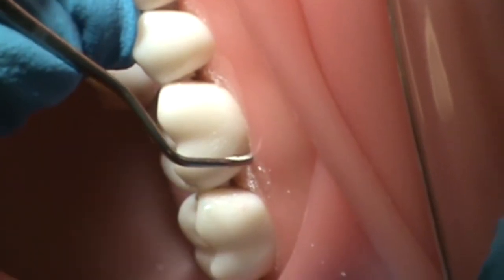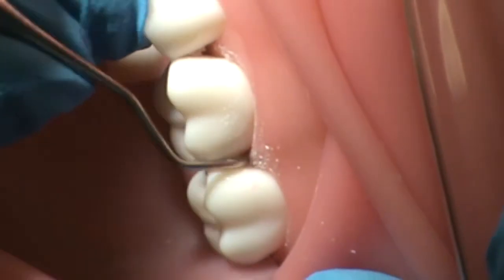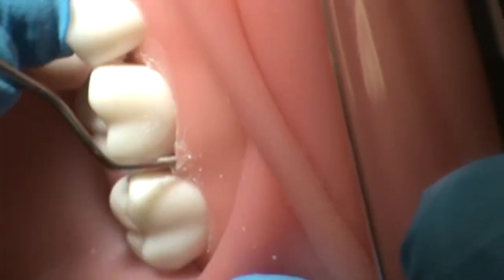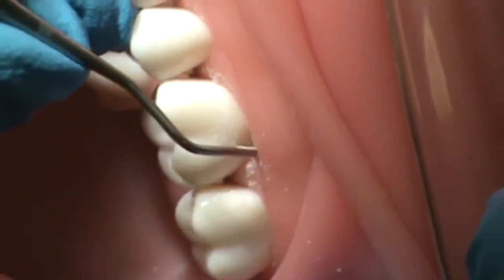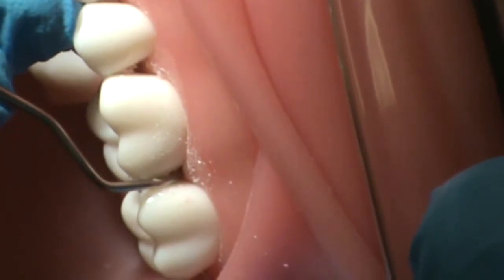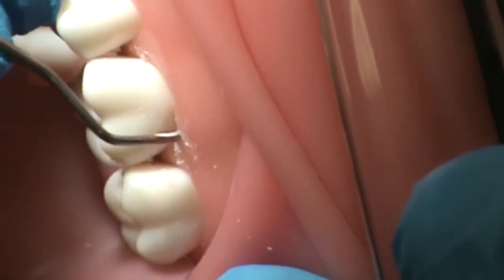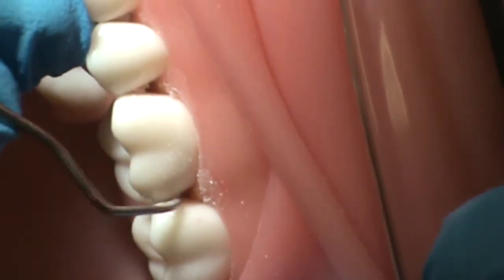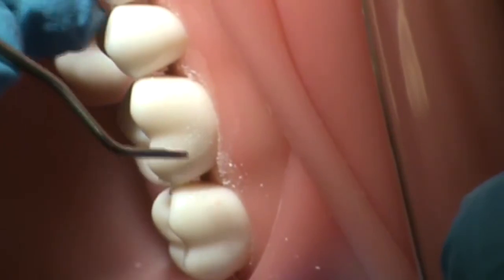Her initial stroke will be in a coronal direction and she will utilize short controlled overlapping strokes of either vertical, horizontal, or oblique nature, applying appropriate lateral pressure and keeping the cutting edge in contact with the tooth at all times. She will roll the instrument handle as she moves across the facial surface towards the distal, paying particular attention at the distal facial line angle. Her strokes will extend into the inner proximal and under the contact, all the while utilizing a wrist rock motion as compared to finger motion.